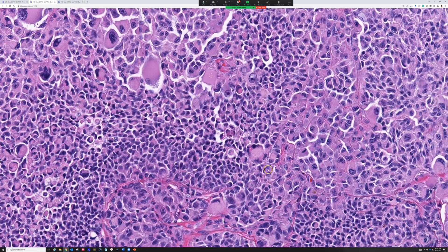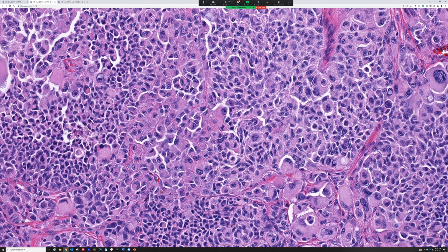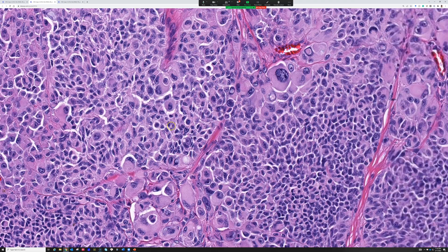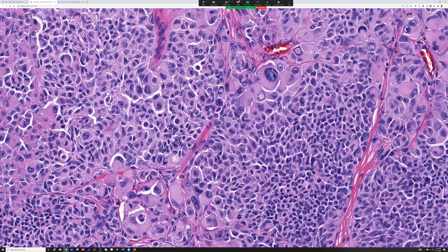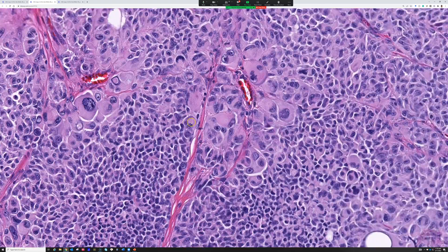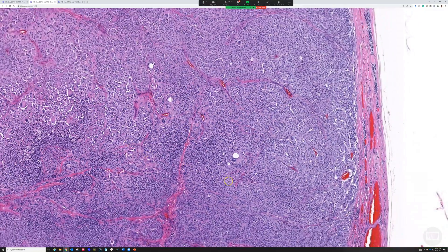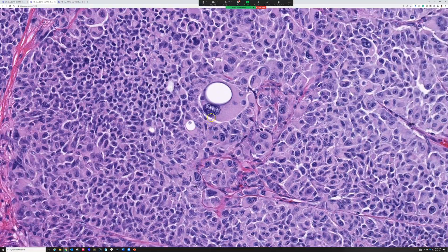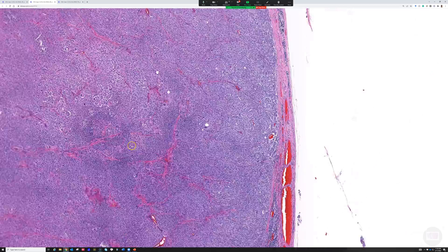Yes, those are rhabdoid cells. A rhabdoid cell is not a specific cell type; it's a cytologic pattern that can be seen in a variety of different things. To my eye, rhabdoid and plasmacytoid are closely similar things. Some people define rhabdoid to be strictly when it has the pink globule, but they are very much overlapping. Look at the pleomorphism — just wild atypia in this tumor.